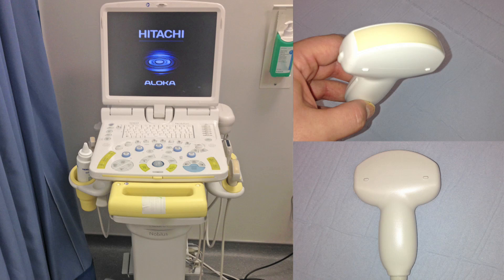A portable ultrasound machine is required. At this institution, the neurology department has recently acquired one, but it is kept in a stock room in the neurology offices on level 7. In other hospitals, a machine can usually be loaned from another department such as intensive care or the medical admissions unit. We recommend using a curvilinear probe and abdominal scanning pre-settings if these are available. Adjust the ultrasound settings to acquire an image; depth field and contrast can be adjusted if necessary.